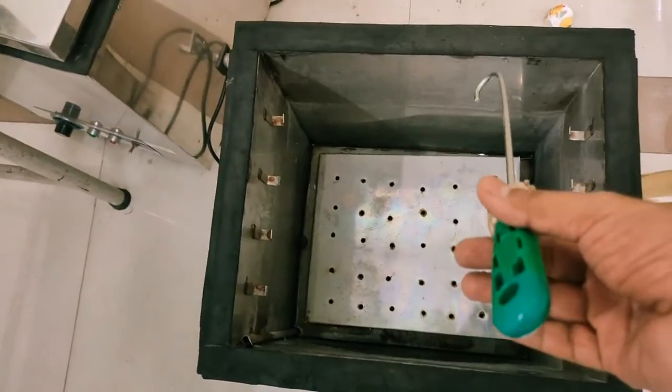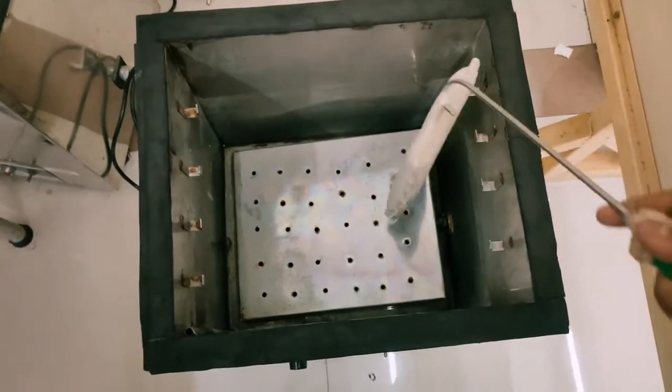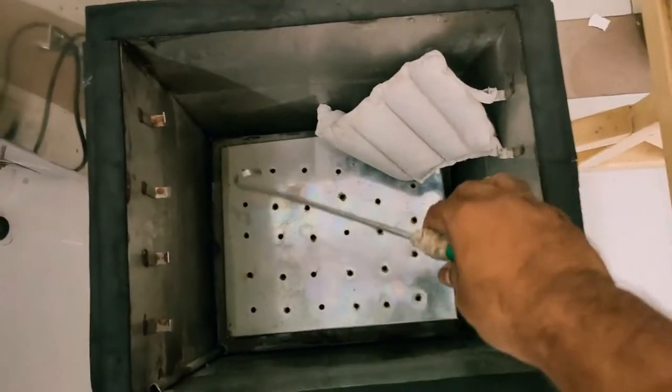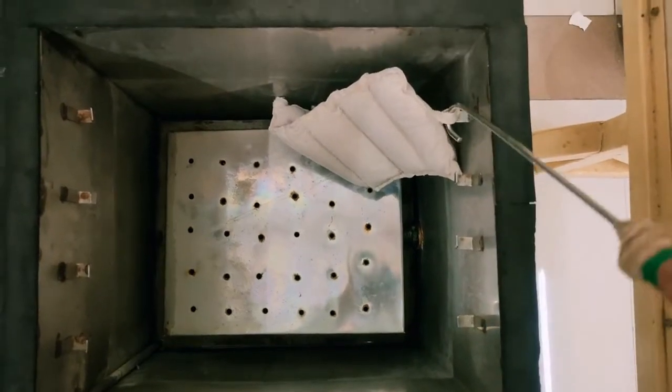These are tongs. With the help of the tongs, you can pick up the hydrocollator packs. The water inside the hydrocollator unit is very hot, so you must not dip your hand inside as it could cause burns. Using the tongs, you safely remove the hot pack from the unit.